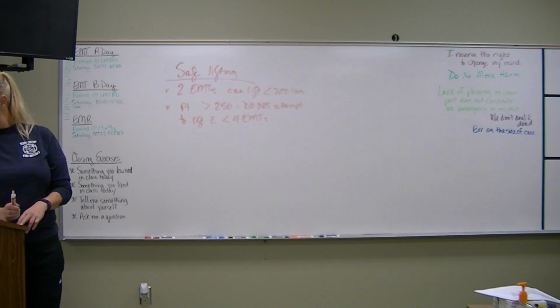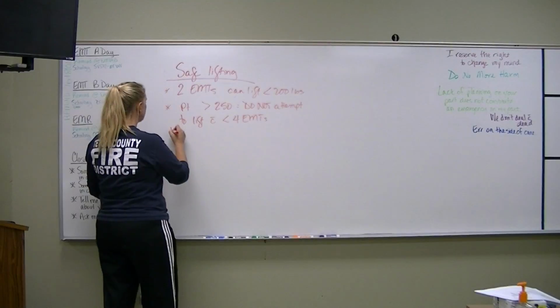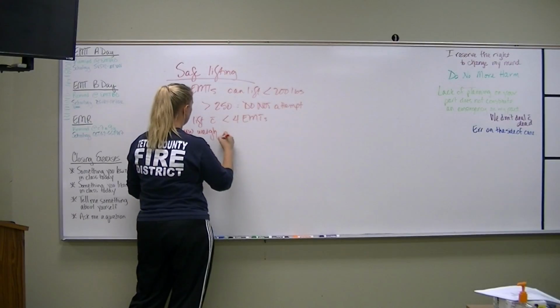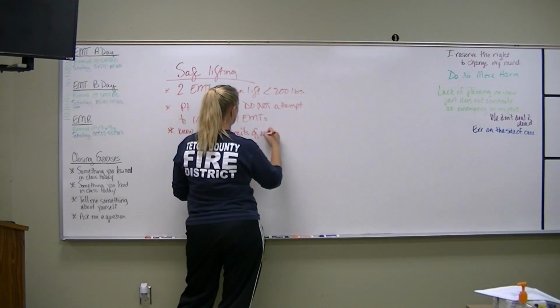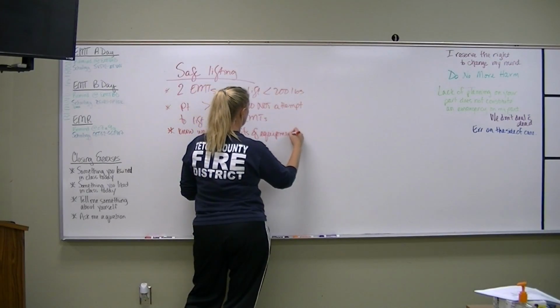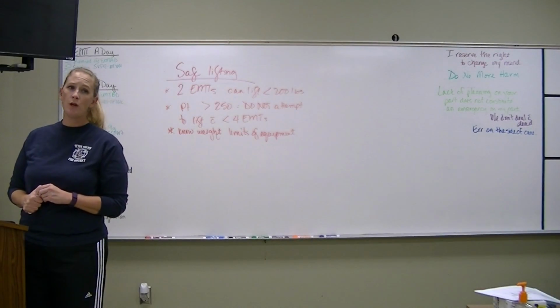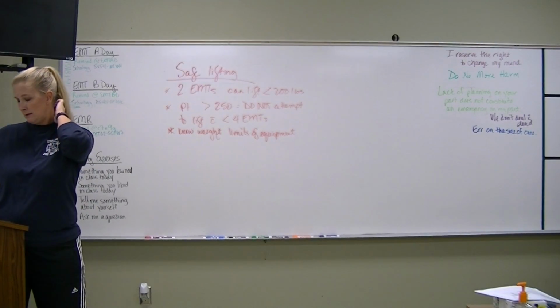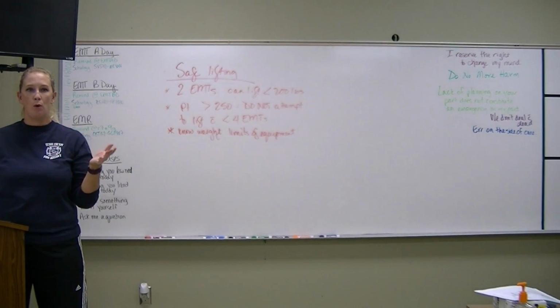The other thing you need to remember is to know the weight limitations of your equipment. Spend some time playing with your equipment. Make sure you know how to use it. The stretchers that I have here in my classroom: I have one yellow stretcher, which I can't remember the brand name of now, but I have 2 of the old silver stretchers, right?